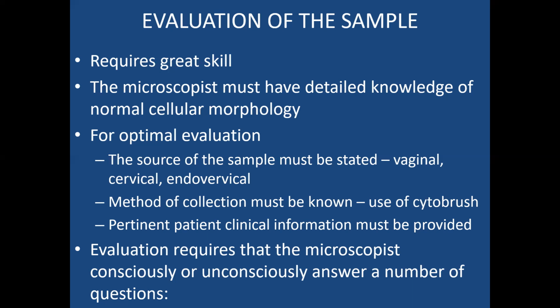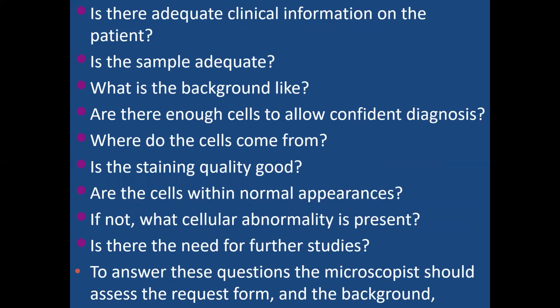Now, during the evaluation, you, the one doing the screening, the microscopist, either consciously or unconsciously, will be answering a lot of questions as you screen. There are so many questions, and these are the possible ones. You're asking yourself, whilst you're looking at the slide, is there adequate clinical information on the patient? Is the sample adequate? What is the background like? Are there enough cells to allow confident diagnosis? Where do the cells come from? Is the staining quality good?